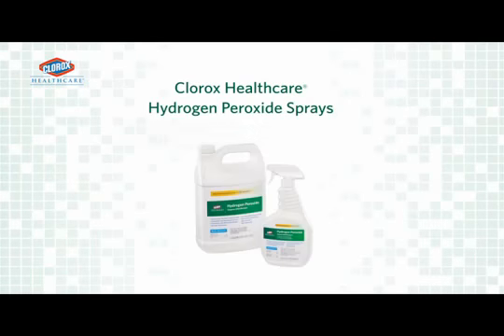This module will provide information and step-by-step training demonstrations for how to use Clorox Healthcare Hydrogen Peroxide Sprays. The Clorox Healthcare Hydrogen Peroxide Cleaner Disinfectant Spray formulation was designed to provide effective hospital disinfecting and is available in a 32-ounce spray bottle as well as an economical 128-ounce refill package.